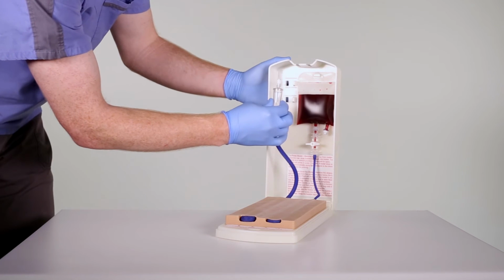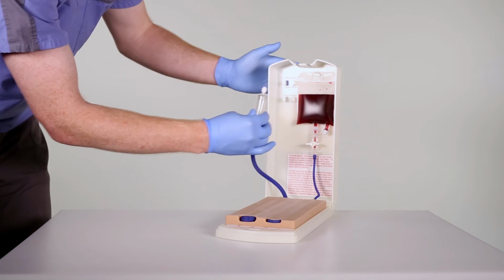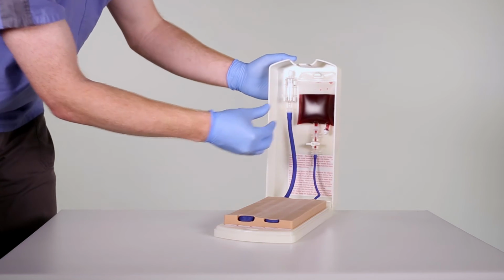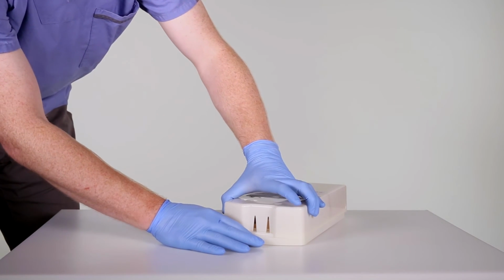Remove bubble trap from holder and screw cap on. Replace bubble trap. To close, push cover forward to disengage with the base and close.